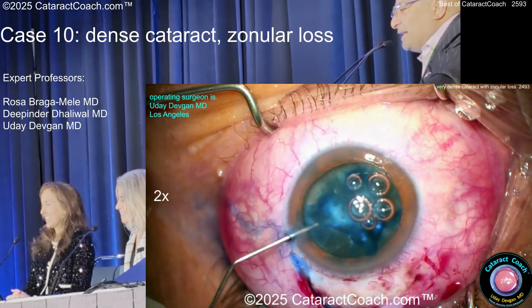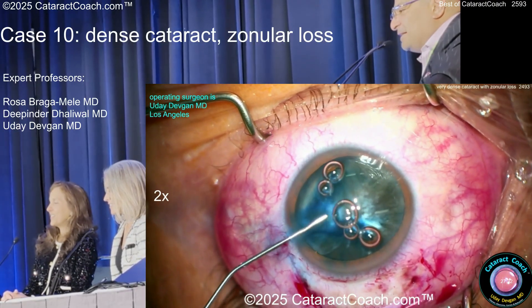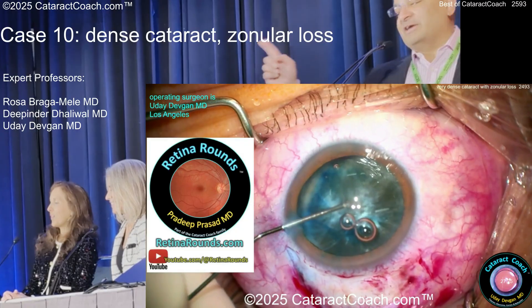Got some air bubbles there which I need to get out — you've got to have a pretty video. Here's more viscoelastic; bubbles aren't coming out, so I'm going to aspirate them manually.